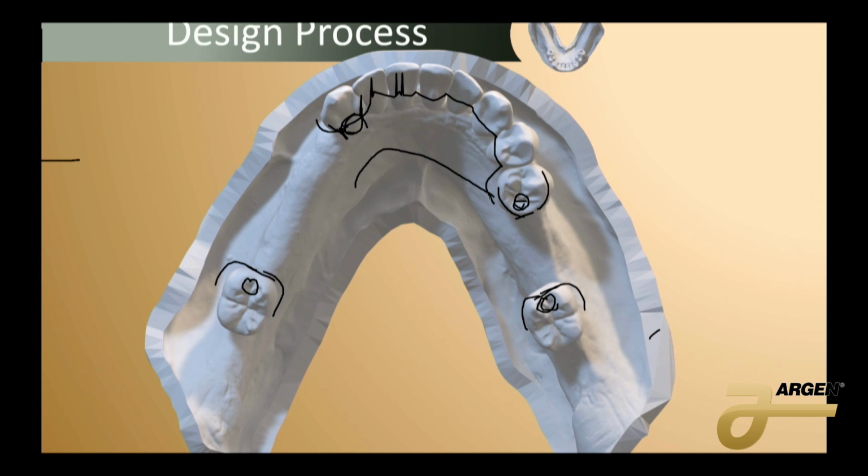And we don't have the space for a lingual bar, so we can make adequate thickness by plating it. When you're plating it, you can still blend it into the teeth nicely. You can still have a nice cleansable partial. It's not bad to plate your partials. If you don't have the space for a lingual bar, you can't squeeze it in there. Some people's lower jaw isn't made for a lingual bar. And then you would go in and do your little mesh, do your little mesh.